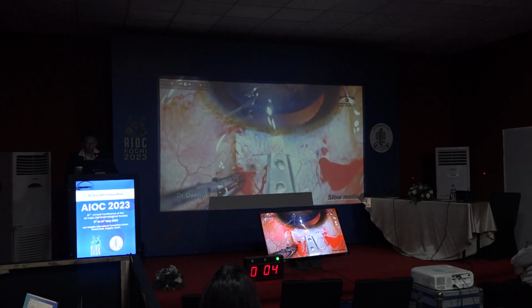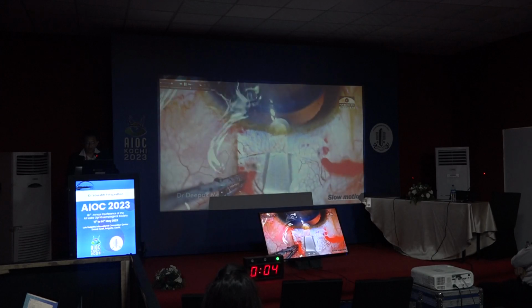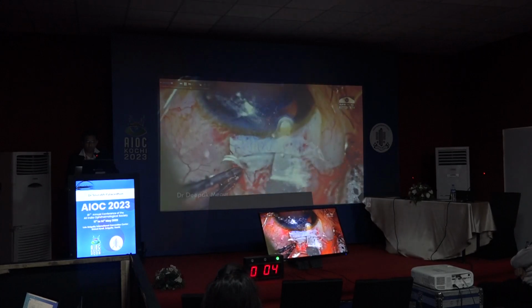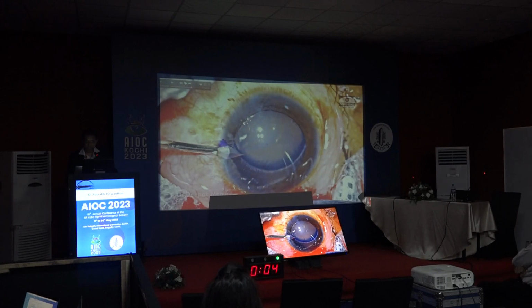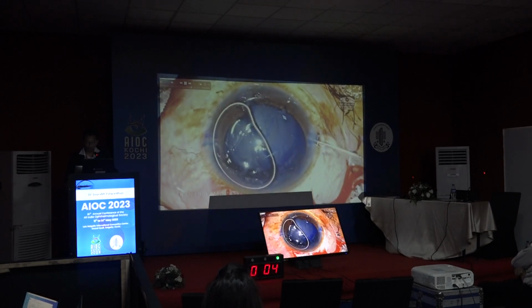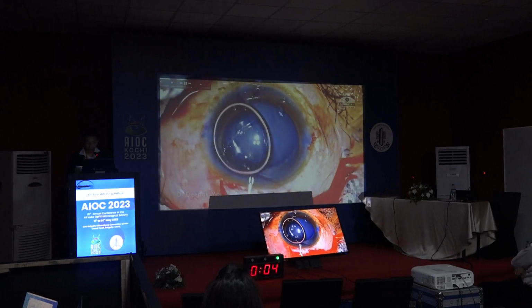So once we create the scleral tunnel, we are creating it of adequate size, about 6.5 millimeter. Now the iris claw lens, as we all know, comes only in a PMMA rigid lens. So when making the side port incisions for fixation, this is extremely important: we just mark it and then use a very short tunnel. It has to be very short. We don't want to have any tunnel here. Direct stab entries would be much easier for us to do the enclavation part.